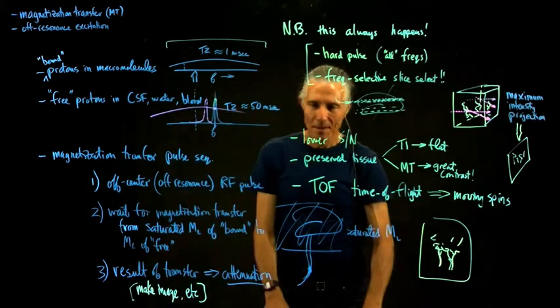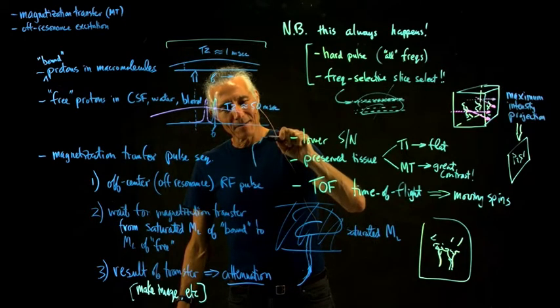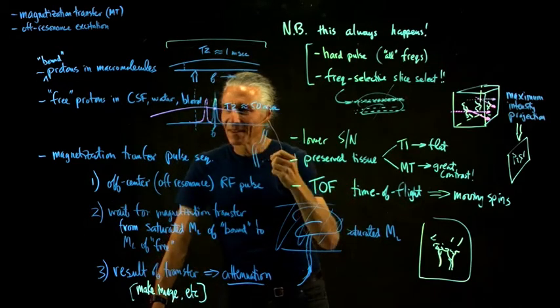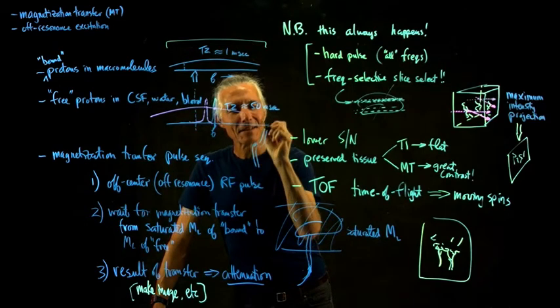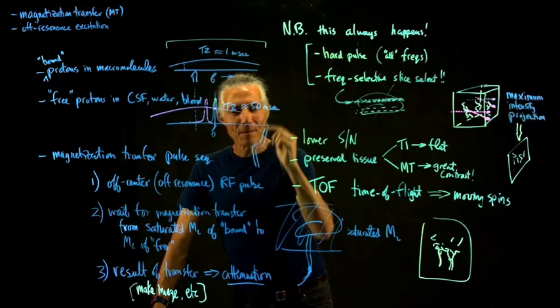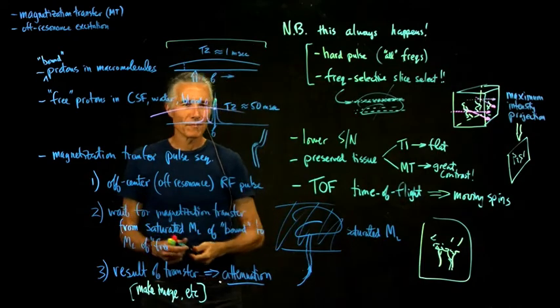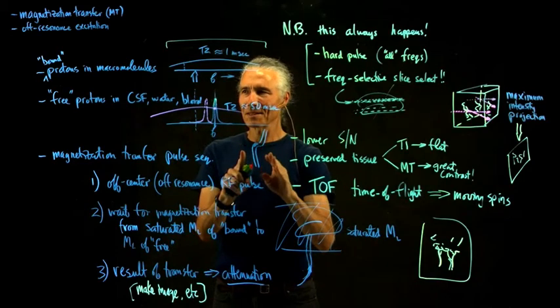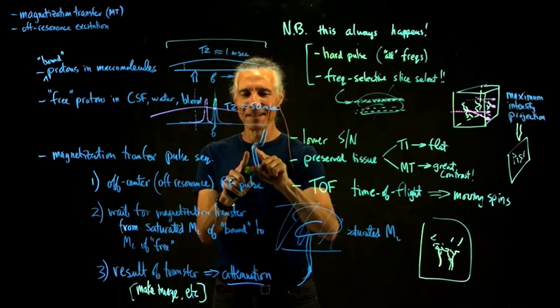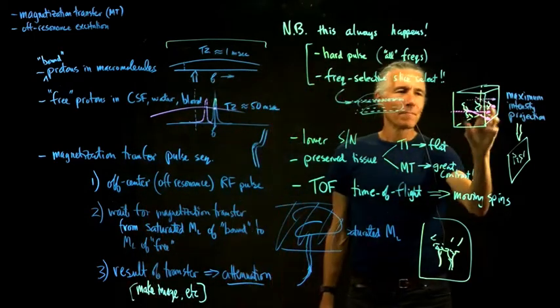And what kind of problems do you get? Well, if your carotid has a little bend in it, sometimes, and you eat too much rich food, you get a little crud building up right in that bend, and that's the main blood supply for the side of the brain. And if the crud builds up too much, it can really restrict the flow. So I always tell the students, eat more plants. It's always good to eat more plants to keep that clear. But that's the kind of thing you would look at with this kind of picture.